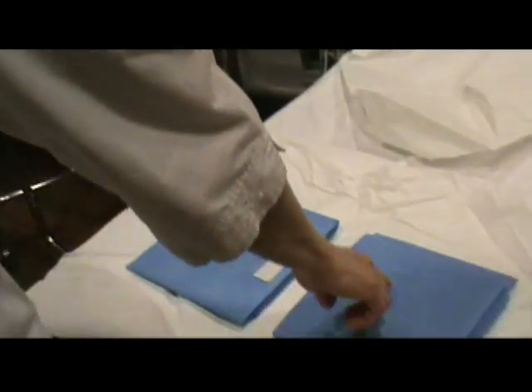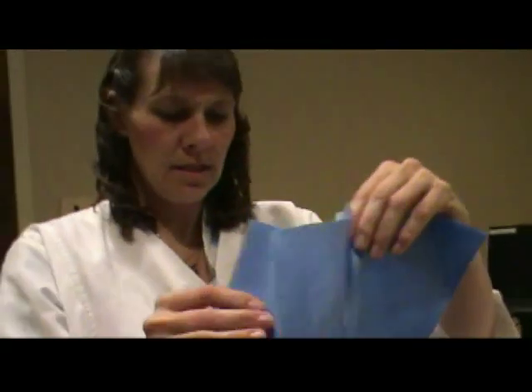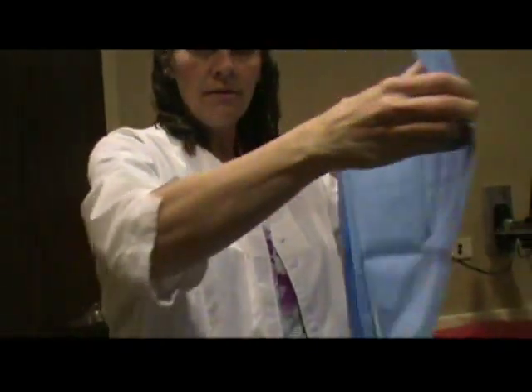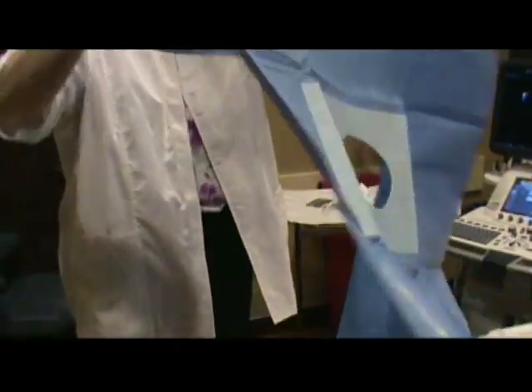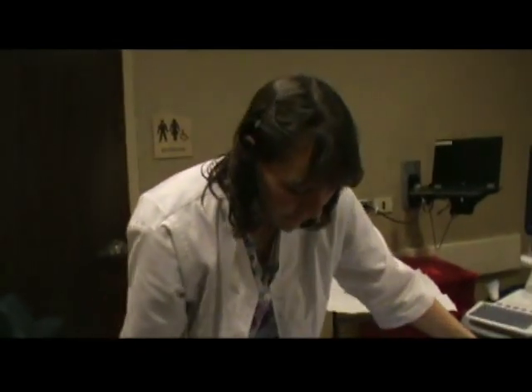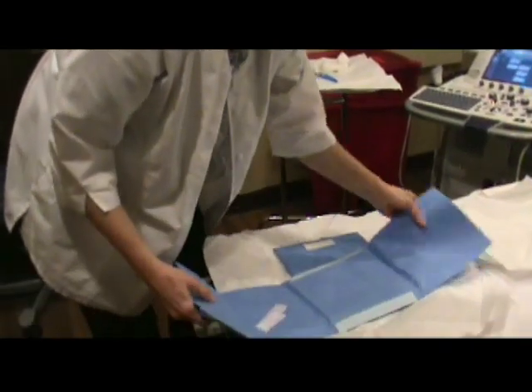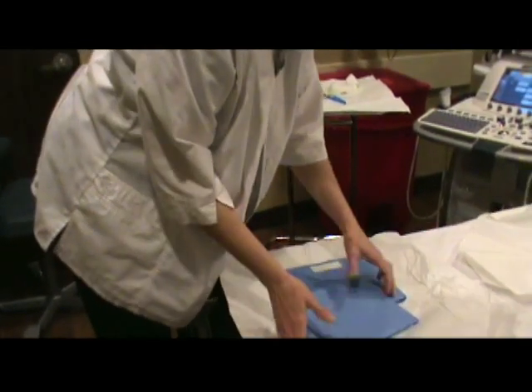The ultrasound 401 breast biopsy draping system is presently in a change. This is the old version, of which you'll see the head when you open up the package will show this way. And you can open this up just like this. The sticky tabs are on the back of this one, so you'll have to remove that first and then place it onto the breast. We've changed that to make it easier for the consumer. Those won't be available for still probably several months.